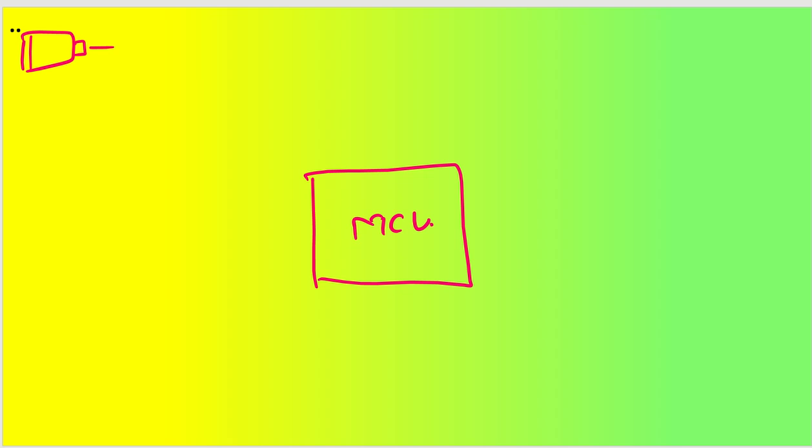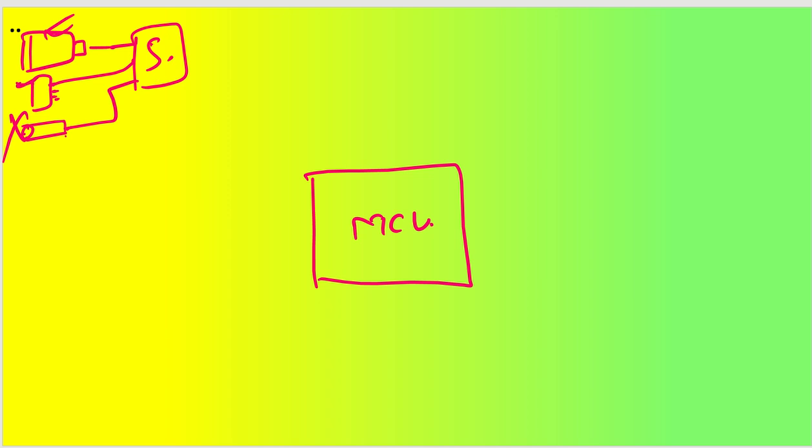Let us say we have one USB connection also, and if you want, you can give one power jack also. Now we'll have a switch application here. Using MOSFETs or some switching application, we'll try to connect all three here, based on the application. Right now I'll suggest you can discard this jack. We will have just the battery as well as the USB connection.